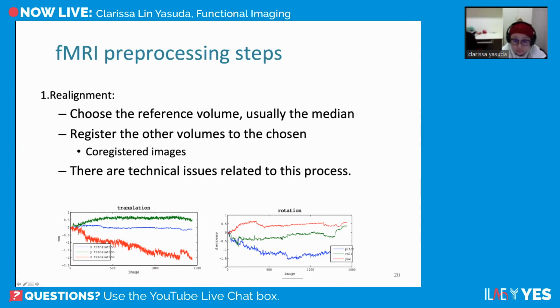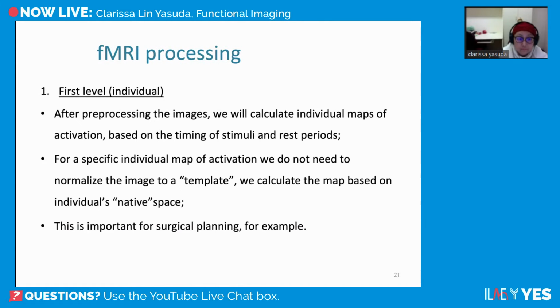Sometimes if the subject moves too much, it's not possible to use that image, okay? So there are a lot of technical issues when you are pre-processing the images, but I don't think it's the purpose of this webinar today, okay?